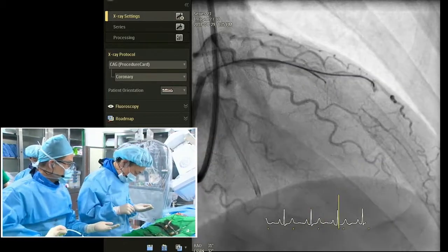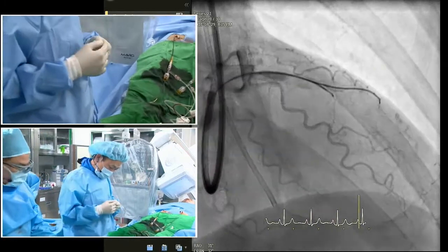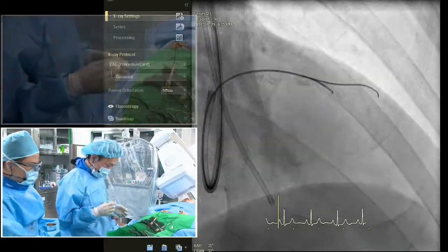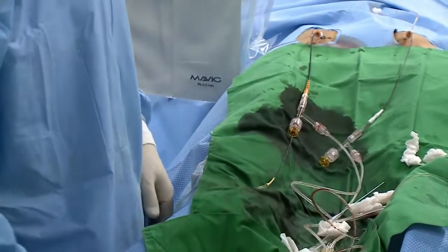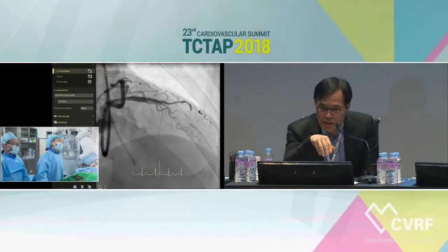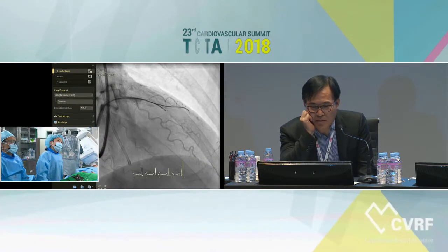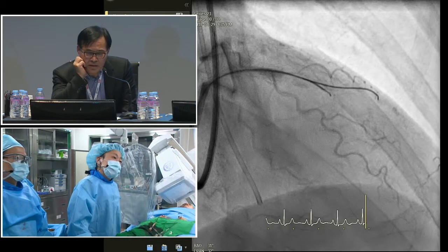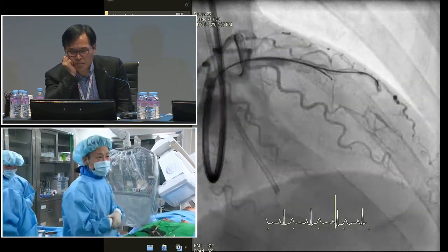Dr. Igarashi? Dr. Nasu? Yes? Yeah, I'm Dr. Joe. What do you think about the review the CT angiography before the change? Because CT angiography can show the calcium or direction of occludal lesion. Actually, inside the CTO segment is very few calcium. Can you show the CT angiography? Could you show the CT angiogram for the audience?